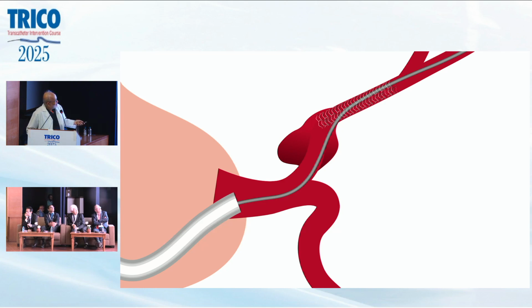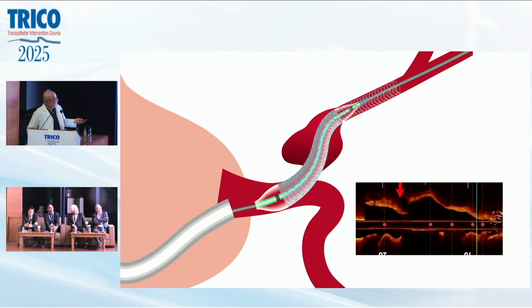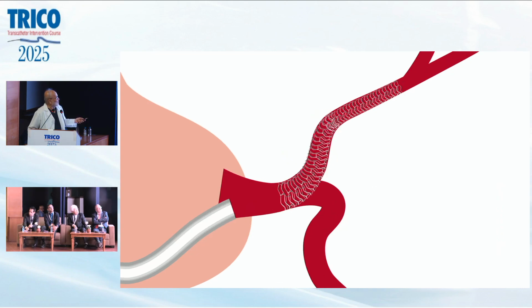My wire and then the OCT catheter as well as the IVUS catheter. This is IVUS. Both went through the strut. And then I saw it on both. I'll show you. Then I found the true channel, the true lumen, and I went in, and then we fixed it with the balloon and stent and everything.